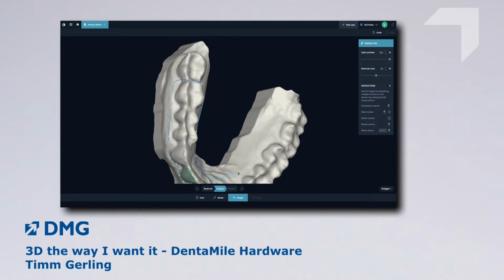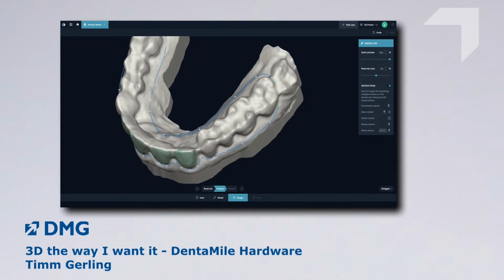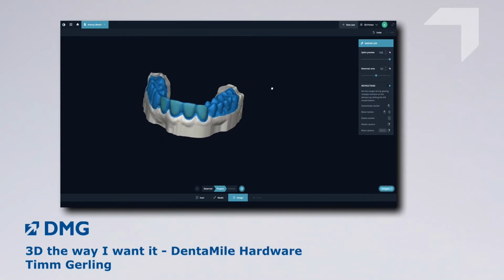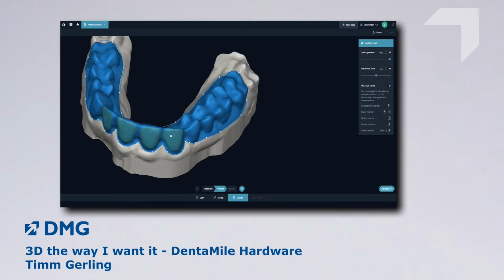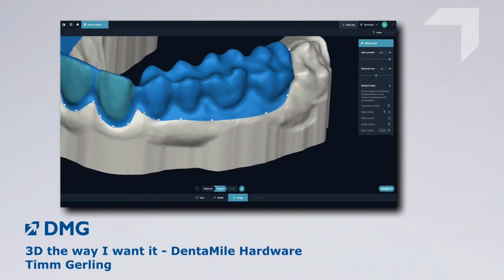Last but not least, we close the line by hitting the green, let's call it ball. The margin line will close, and then we get the visualization of the bottom of the bleaching splint. And here, of course, we also do have the possibility to make some small adjustments and corrections to the margin line.